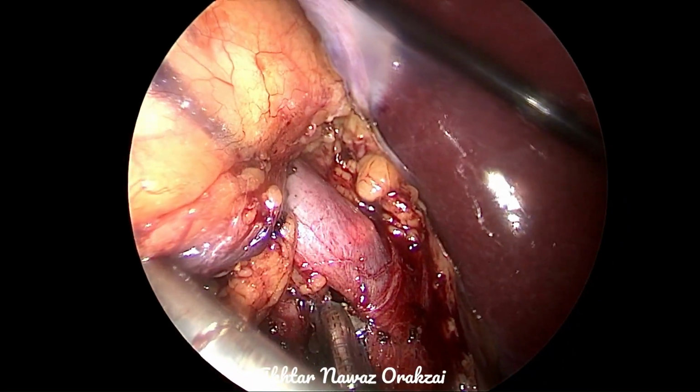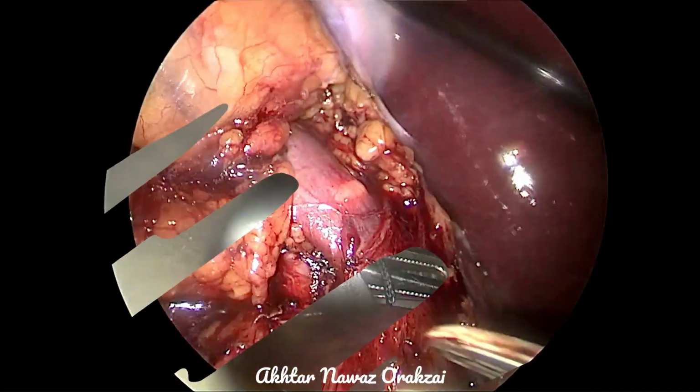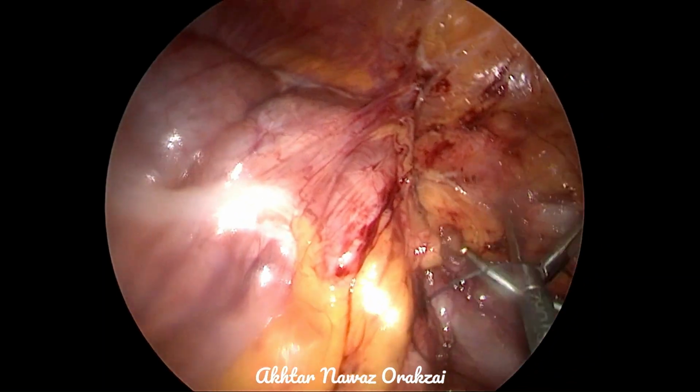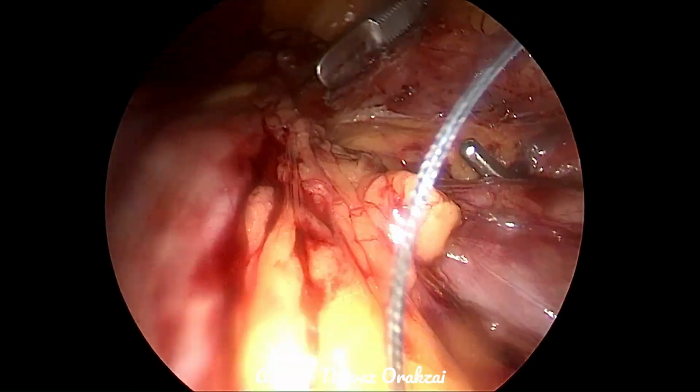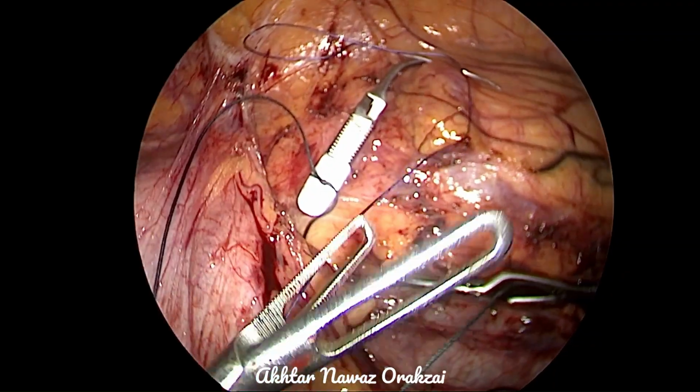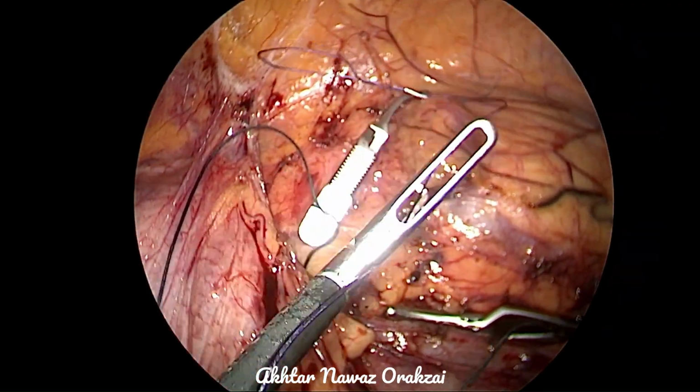So we have dissected between the vein and the artery, but the problem is that the vein is not completely dissected, and we have placed the normal bulldog clamps with the silk so that we do not lose it in the abdominal cavity.